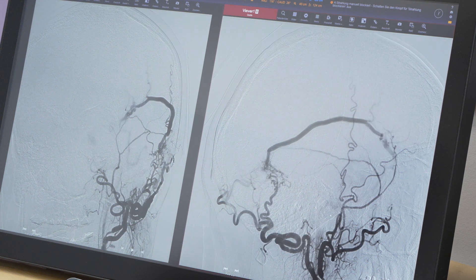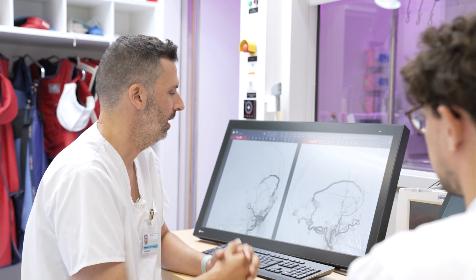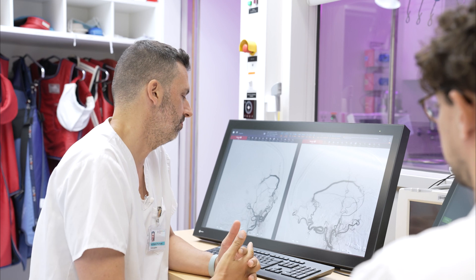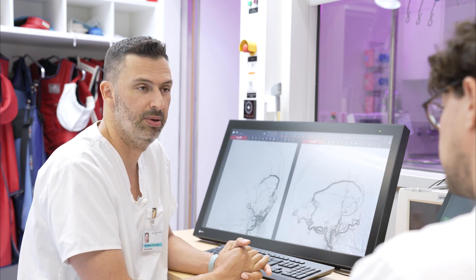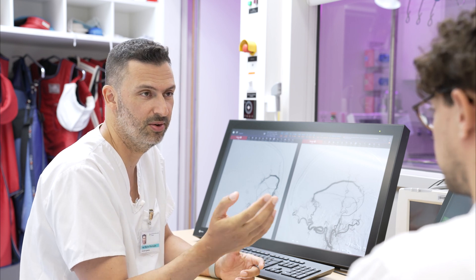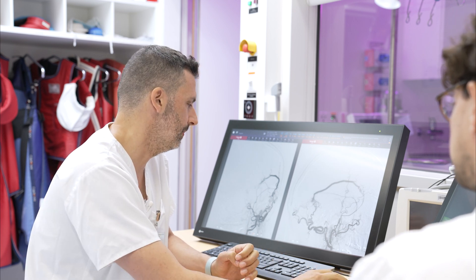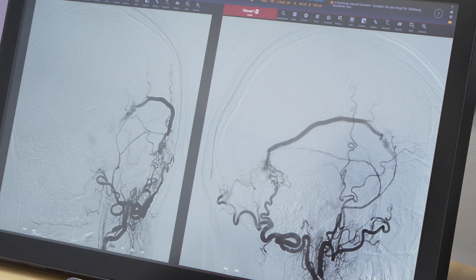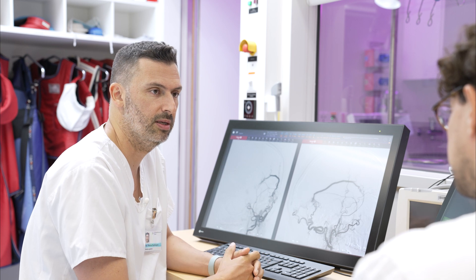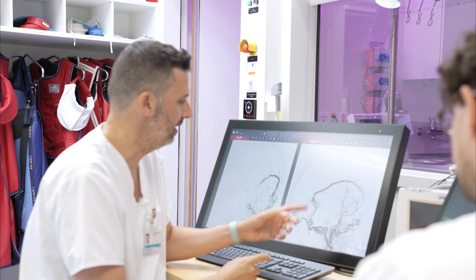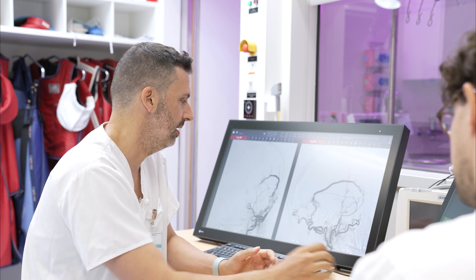There are a lot of ways of treating this fistula — one could operate and surgically occlude the vessel. We opted for a balloon-augmented pressure cooker technique, which we really like and do frequently for fistulas in Basel. We place a balloon in one of the feeders, inflate it, and then through this dual-lumen balloon — usually the Scepter or Scepter Mini — we inject liquid embolics like Onyx to occlude the fistula, the collecting vessel, and the proximal part of the vein.